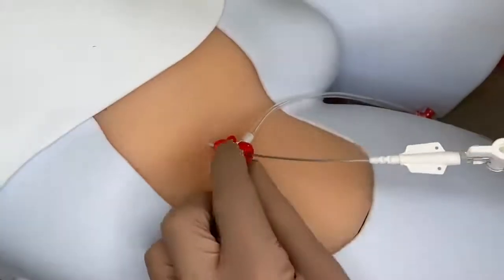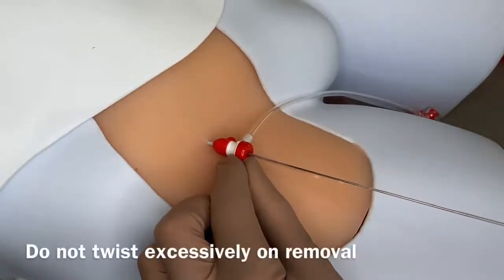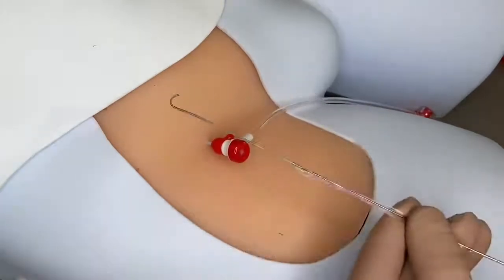Detach sutures and remove the device, keeping the sheaths secure. If there is resistance, stop withdrawal and repeat the balloon deflation step.